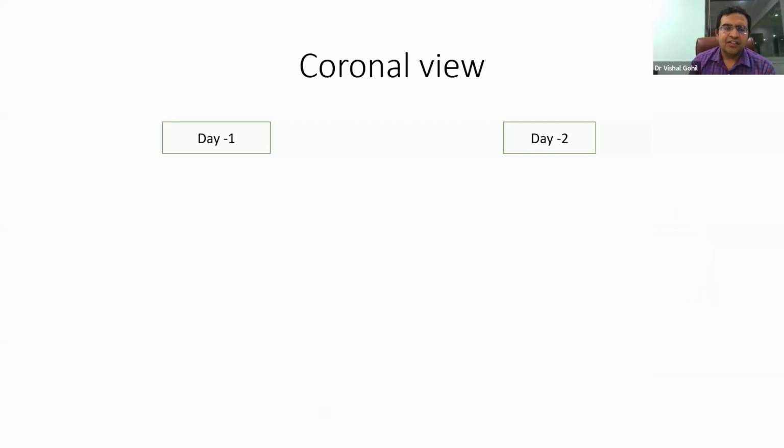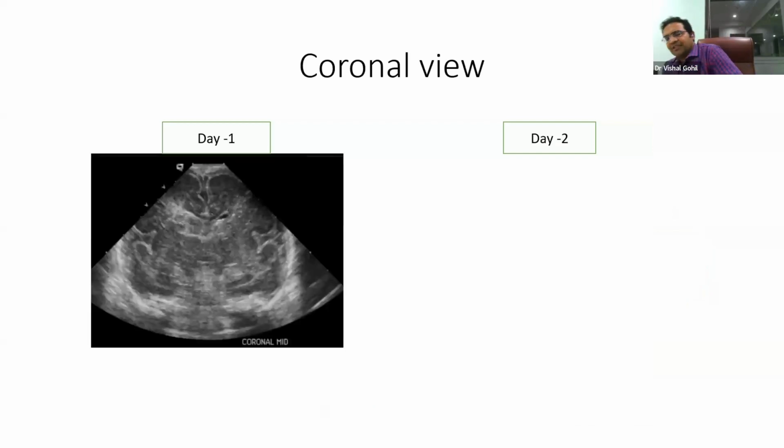Okay. Sometimes, like in the extreme preterm baby, you might see a periventricular flare over here. There is no bleeding over here. You can't see the bleeding, but there is a periventricular flare. When we see this echogenic thing outside of the ventricle, we always worry: is it normal? Is it a part of the IVH? Does it end up with PVL? We haven't known. So serial monitoring is required.